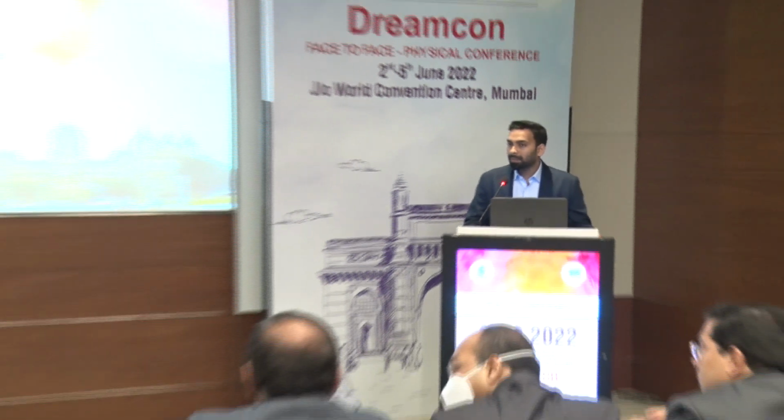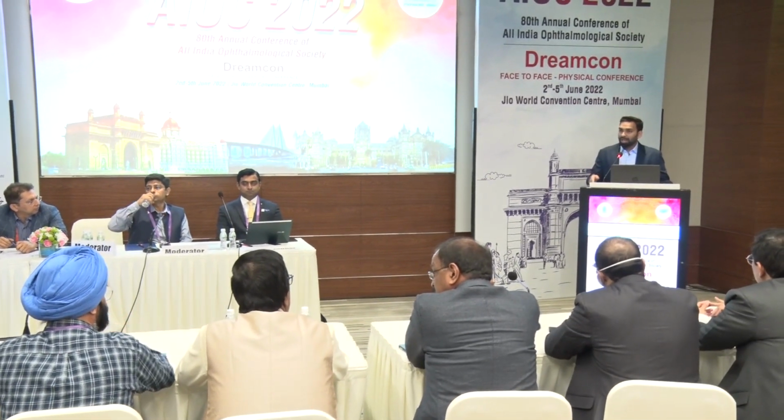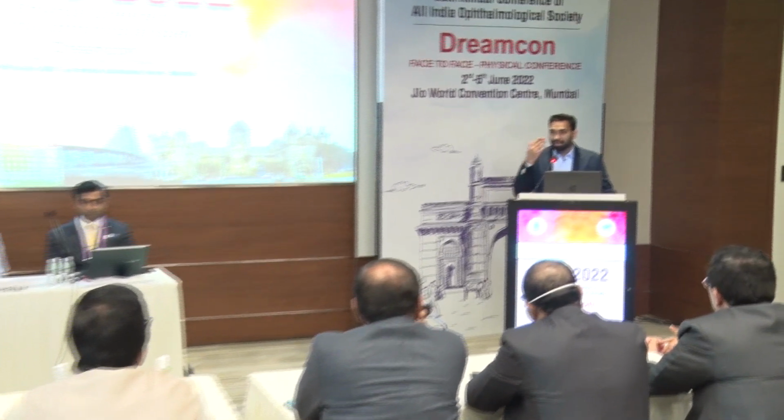Unless and until the optics gets bad, we can actually use it for a long time. Yeah. So you can change the number of IOLs. Like you have used 4, you can use 1, 2, 3 depending on the power. Actually, we used one IOL with the 20 diopter lens for anterior segment photography, and subsequently I started adding more IOLs of the same power, and that is when the IOL scope was made.